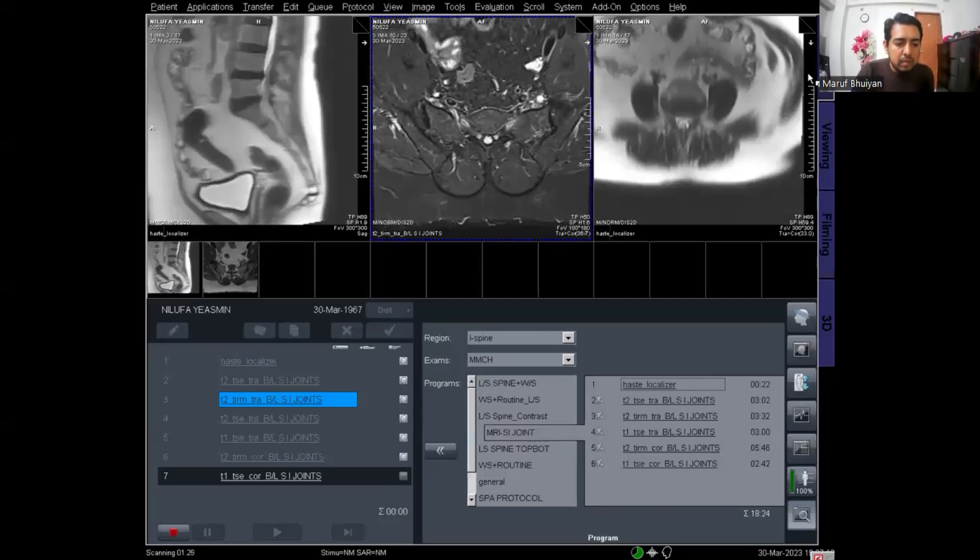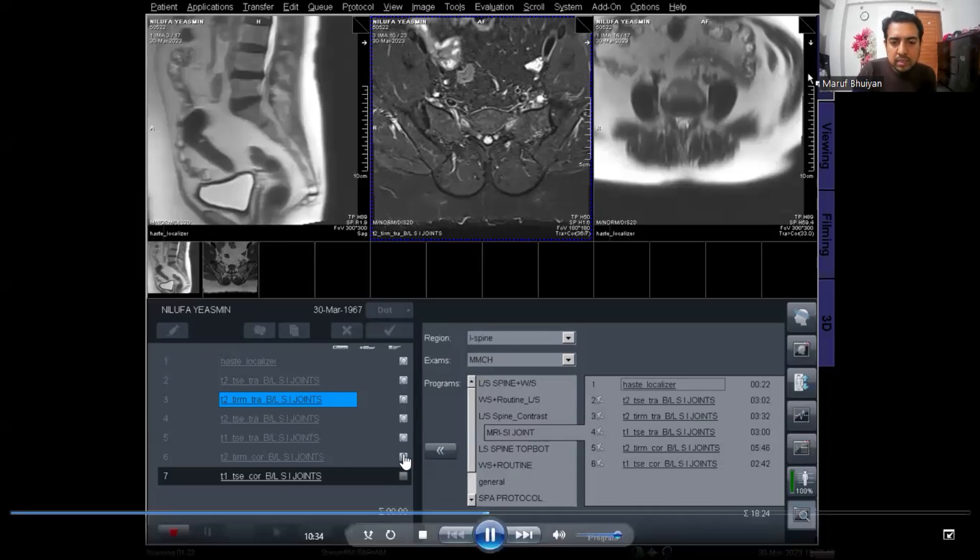My T2 STIR coronal has finished and T1 coronal is now running.